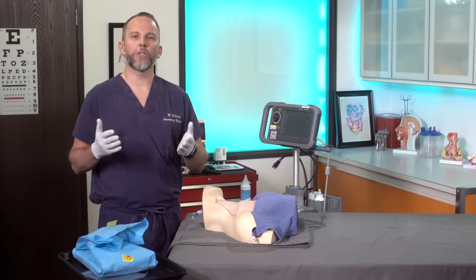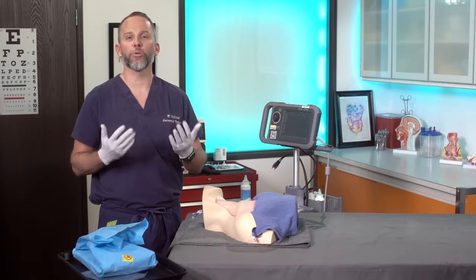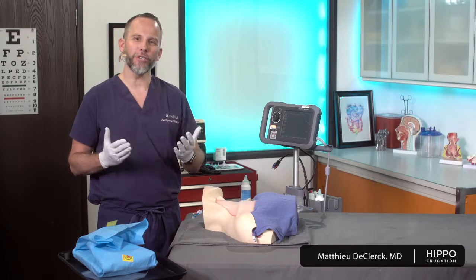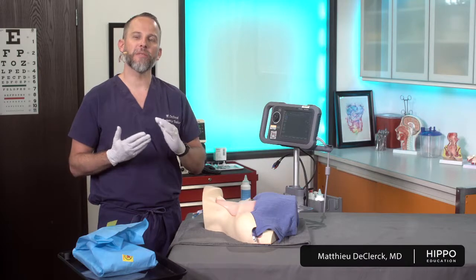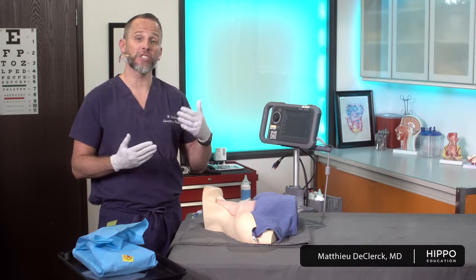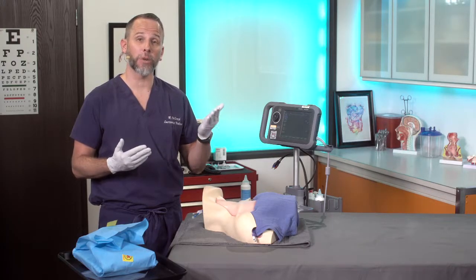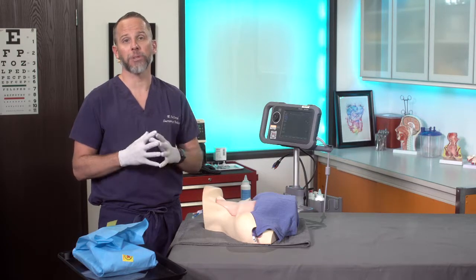In this video, we're going to go over how to place a central line in the internal jugular vein using ultrasound guidance. This is really one where you could use your anatomical landmarks like we've done traditionally, but because there's some variation in terms of where the internal jugular vein lies in relation to the carotid artery, it's really best to visualize that directly with ultrasound before placing the line and during line placement.